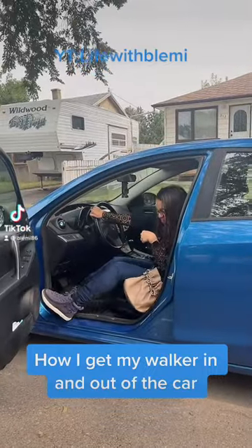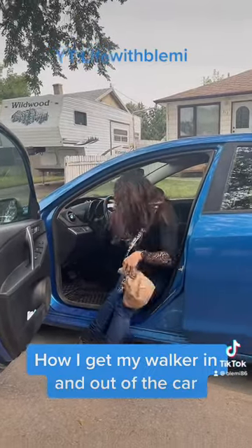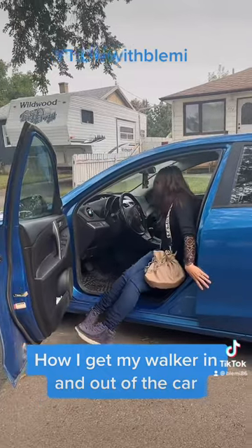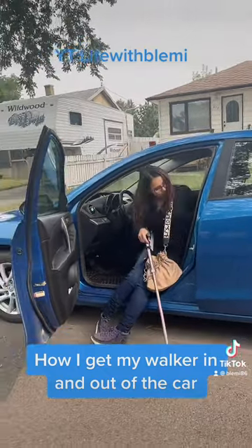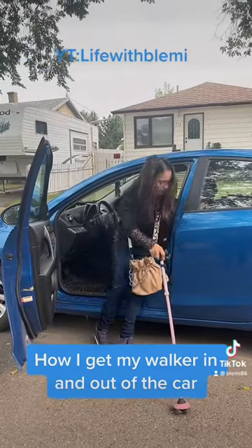How I get myself in and out of the car with the walker. First I have to get myself out of the car, so I grab my cane so that I can get myself to the back of the car where I keep my walker.